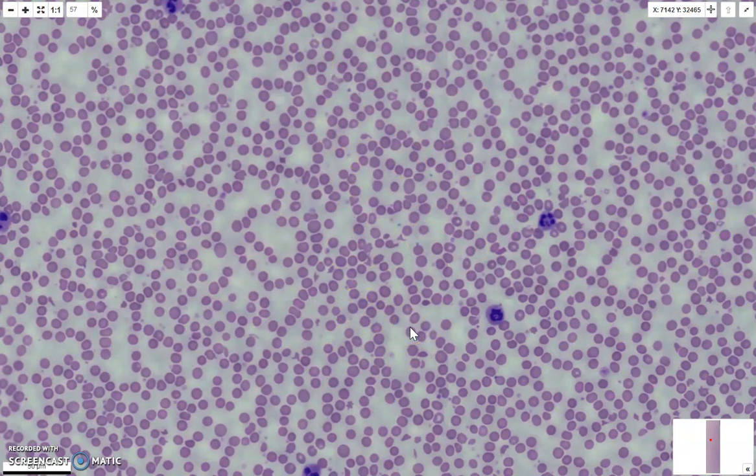The other one is not as obvious. This is slide 5-7A, where the age is 58. It does say child and female, but when I look at the actual counts, I would say it's the female aged 58 is correct, with a hemoglobin of 106, so slightly under compared to the hemoglobin of 66 on the previous slide. Again, normal MCV, normal MCH, and this platelet count is 308.